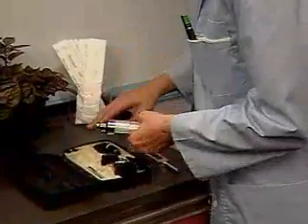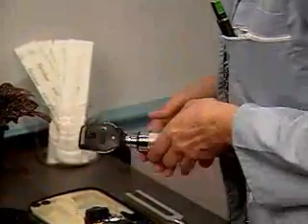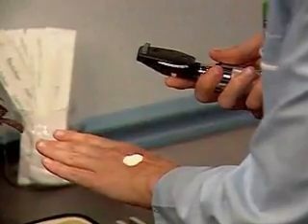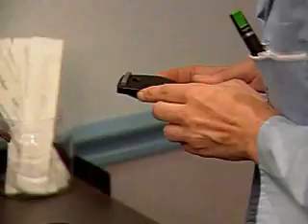When you're ready to examine the fundus, switch on the ophthalmoscope light and adjust it to the large round beam of white light. Also make sure the light is bright enough. Set the ophthalmoscope to zero diopters.